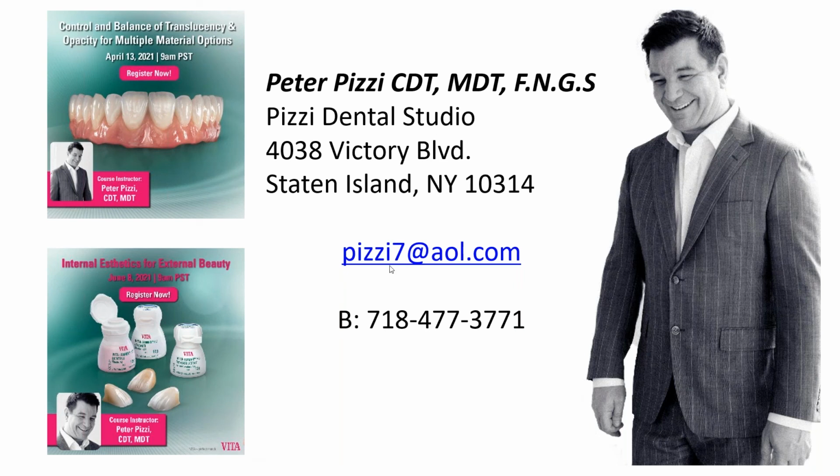With the Shera, I found that the connector paste didn't work as well, and I've kind of gone backwards. I'm just taking a transparent material from VM9, the window, as an example, doing a very, very thin wash and firing it just a few degrees higher, and then building all my ceramic on it. So I'm treating my wash a little bit differently with the Shera, but I have to be honest and tell you, the way it devests and breaks out, it's beautiful. It's almost like powder comes out of the thing, and it's no grinding. It's much nicer.